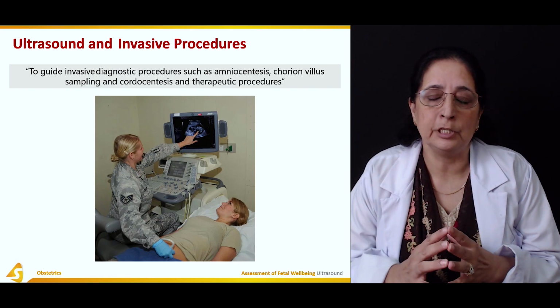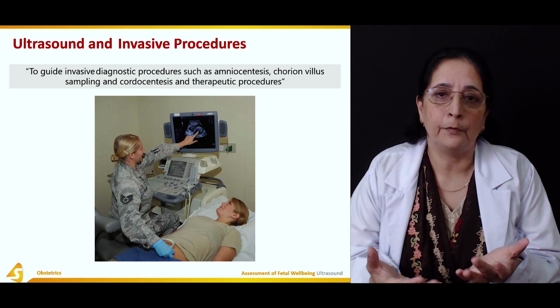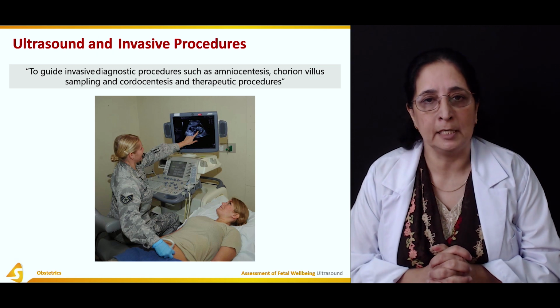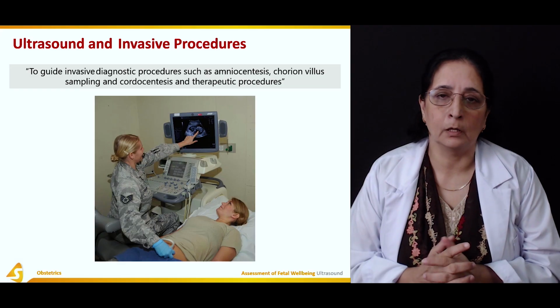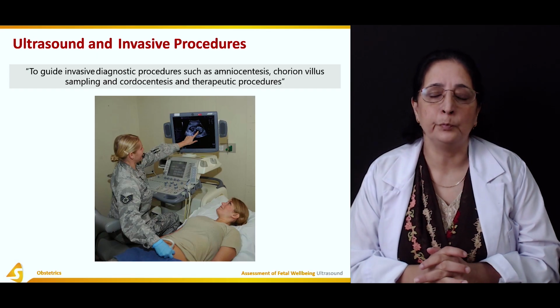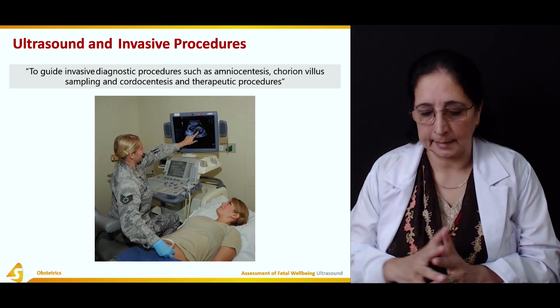If you cannot use the ultrasound and perform these procedures blindly, there are chances that you might damage the fetus, or you might damage the cord or other structures. So it's very important that these procedures should be performed under ultrasound guidance.